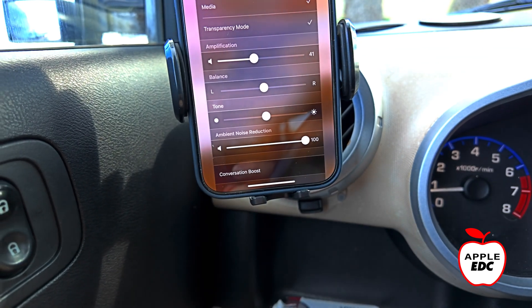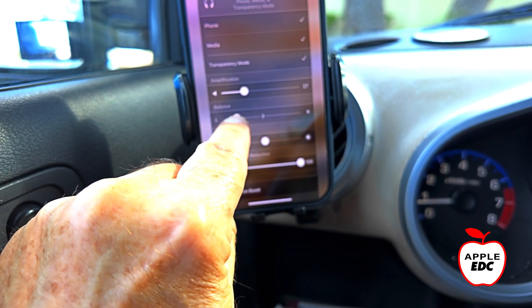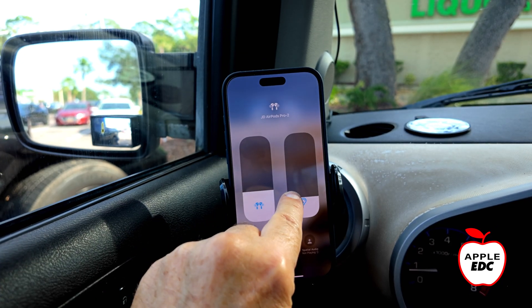It's really nice to be able to change the amount of ambient sound, the balance, and the tone or the brightness — and of course the volume as well — right from the control center. And having separate controls for media volume and for hearing aid volume right there makes it really nice.